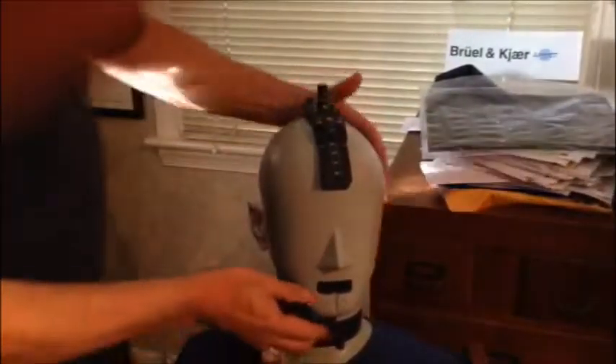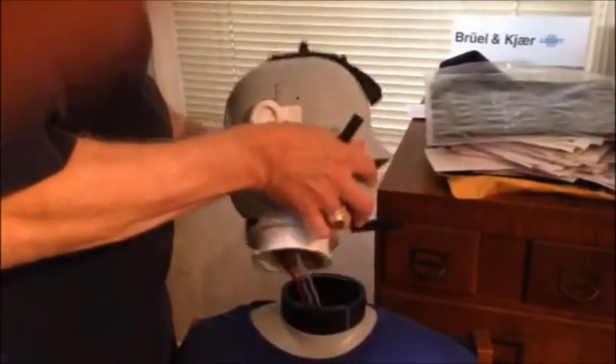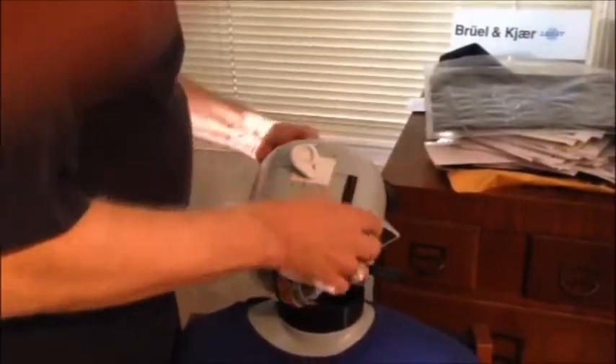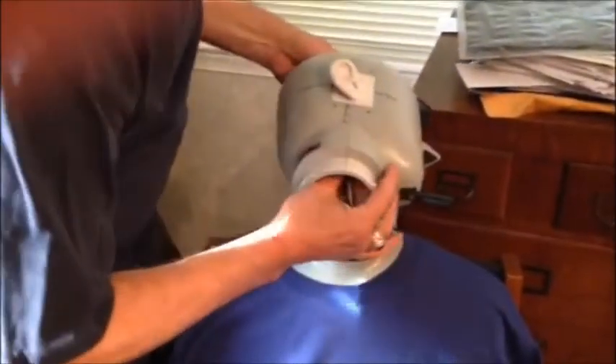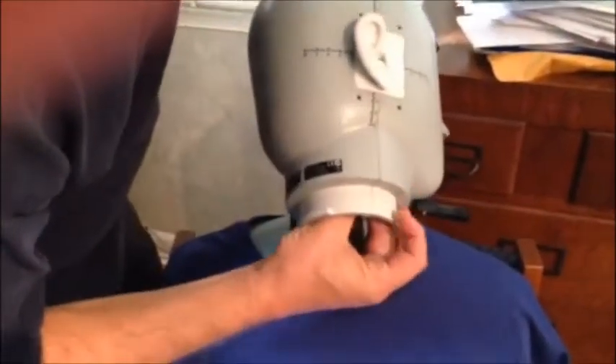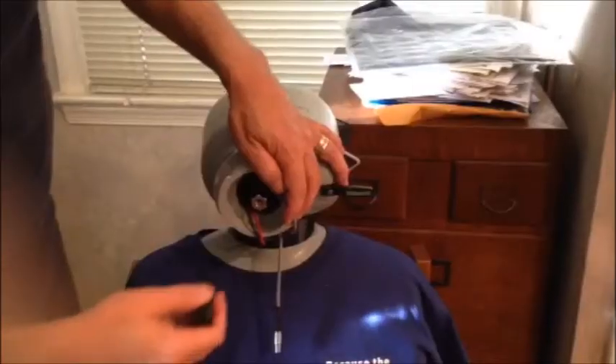The first thing we need to do is remove the head by turning it to right angles and pulling it off, then removing the cable from the preamp. You need to reach in — this is probably the most difficult part because if your fingers aren't tiny it's tough to get in. Got the cable off.